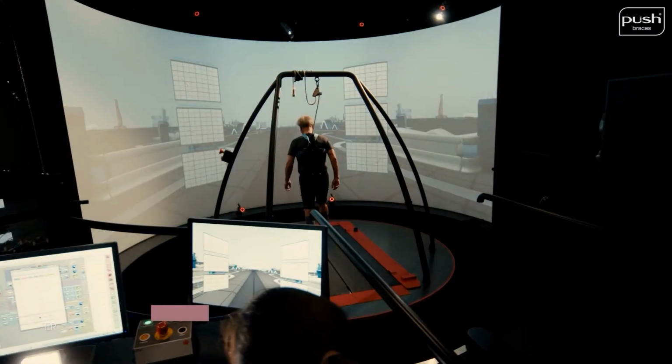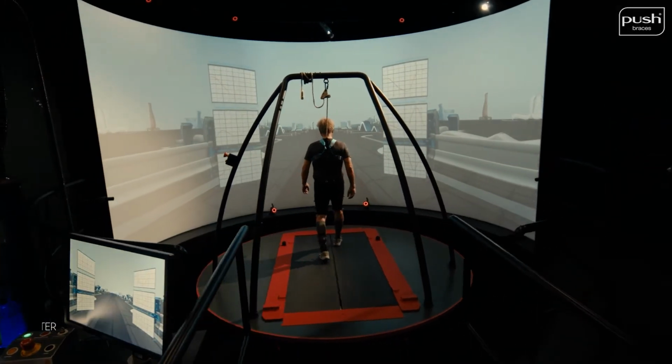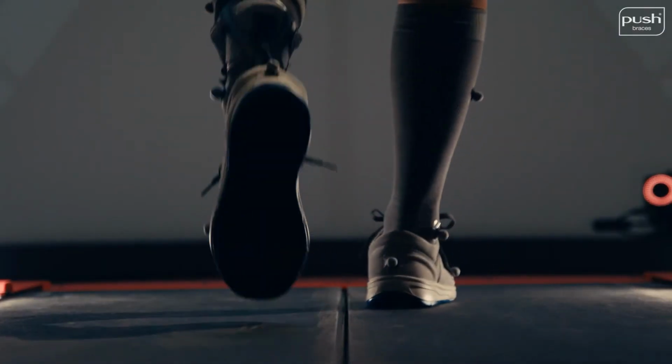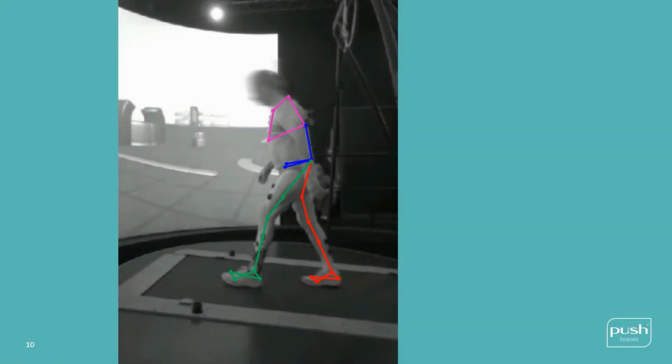Securing the subject in a harness facilitated safe recording of the unsupported gait of a patient. By placing markers, the gait could be measured using a Vicon system. This covers full body movement, joint angles and ground reaction forces. The subject's data was converted via the markers into a stick figure. The stick diagram comprises just the legs and torso. No markers were placed on the head.